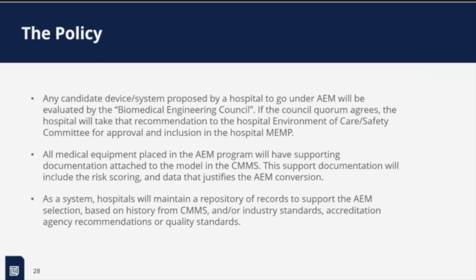I think we anonymized it, it might have had a different name, but the Biomedical Engineering Council is the group within the hospital that makes the judgment on whether something can be AEM or not. If they agree, as you put all this data together, that it can be AEM, they put that in place, and that's how this hospital does it. Is anyone using AEM with a documented strategy?